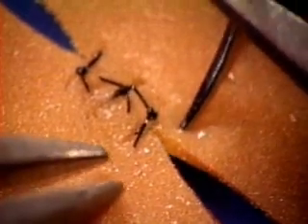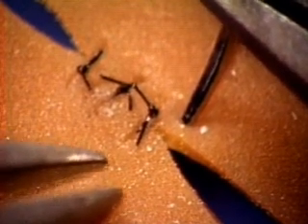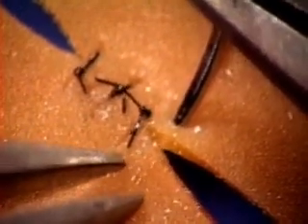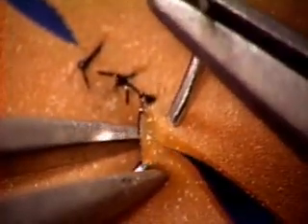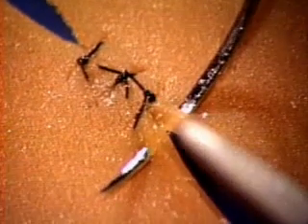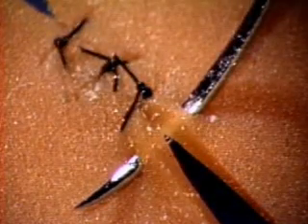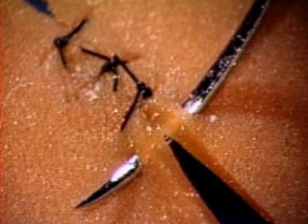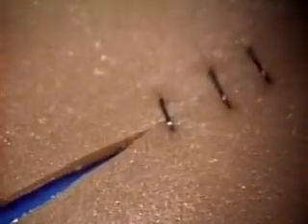Move the needle tip to an exactly matching exit point on the other side. Bring the left hand forceps in from above and press down toward the needle, again everting the tissue as the needle goes through it. Here's what you're aiming to produce: 2 equal-sized bites with the needle crossing the wound at 90 degrees. When that's tied, the underside will look like this, nice and flat.